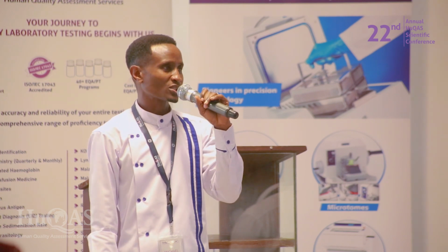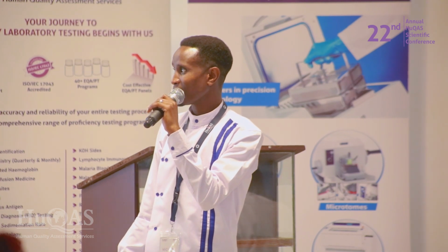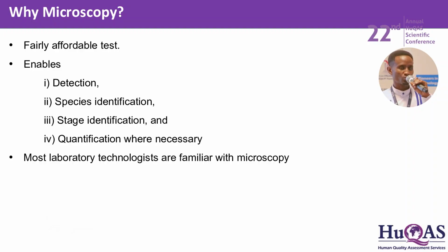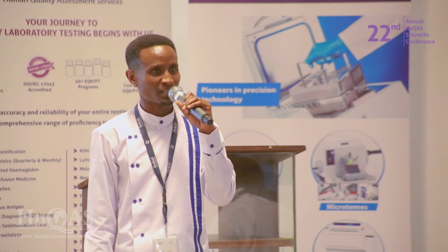This method is fairly affordable. I've said fairly affordable because you require some cost, of course, but it's within the affordability of many labs, yes. We have the advantage of using it because it is able to do the detection. You'll be able to do the speciation, the stage identification, and quantification where necessary. And of course, quite a number of us are familiar with microscopy. So it's a skill which can be nurtured and we can perfect our microscopy skills.